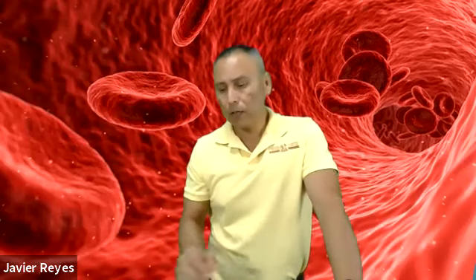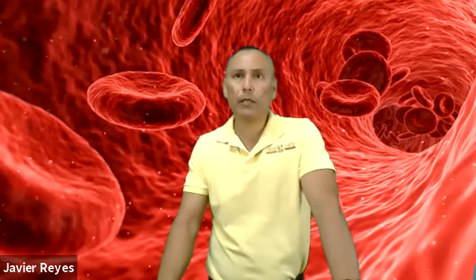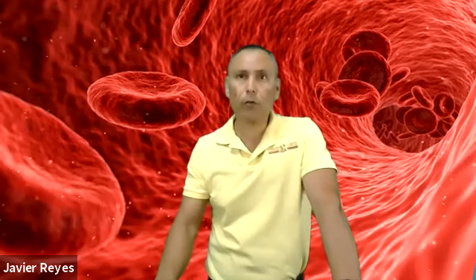All right, so you have no control of it. So what will you do? Well, if you notice this right away, then you should make the selection of the appropriate equipment by using a 10 ml syringe, 20 ml syringe, where you have more control of the vacuum. All right. So if the patient has very small veins, again, they will collapse with the amount of pressure from the vacuum. So you make sure that you collect using a syringe method.